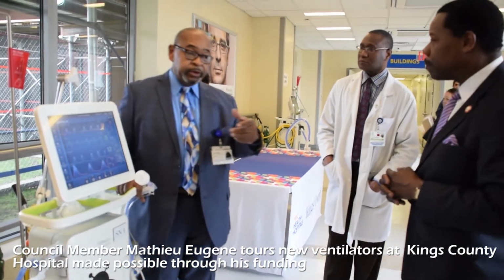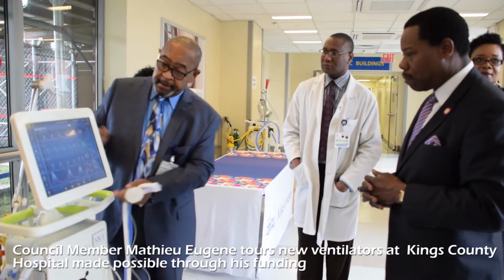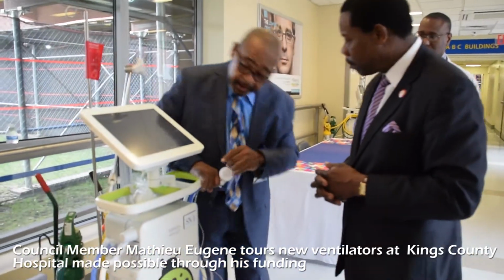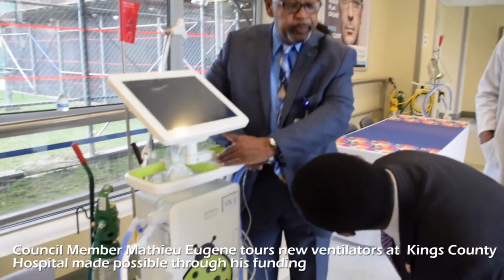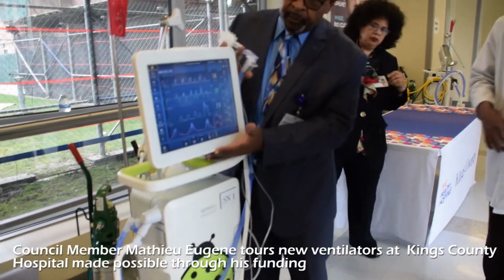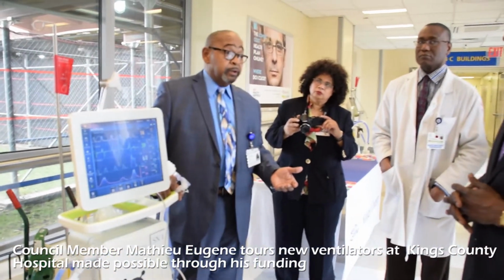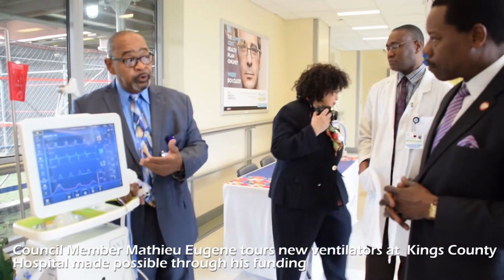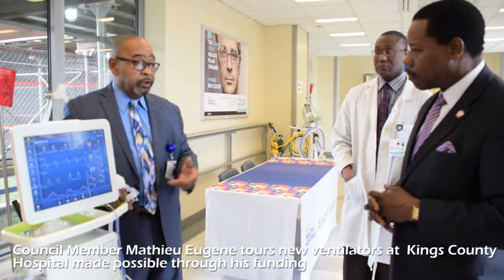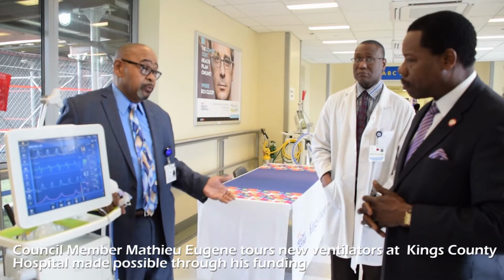It's set up to communicate with the EMR, the electronic medical record. But if you look underneath here, Mary showed you how to do screen captures. There's a USB port. So I can export data from that USB port, put it into a PowerPoint format, and then send it to a physician in another hospital. The RTs have been taught not to put any patient data in there, so there's no HIPAA violation. The only thing they would put in is a medical record number, and nobody's going to remember what medical record number is associated with what patient.